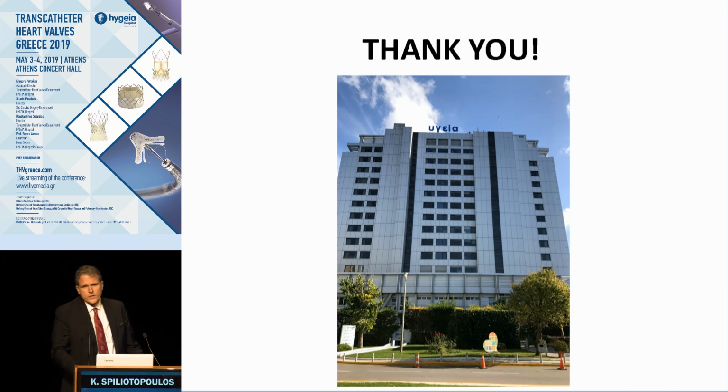The reason I showed this case is that, as we know, with lower profile sheaths and delivery systems, most of the TAVIs are now done transfemoral, and this is the way it should be. But there are 1 or 2% of cases that need surgical access, which could be transapical or transaortic, and every group that does TAVIs has to have these options available, ideally in a hybrid OR environment. So again, thank you very much for your attention.